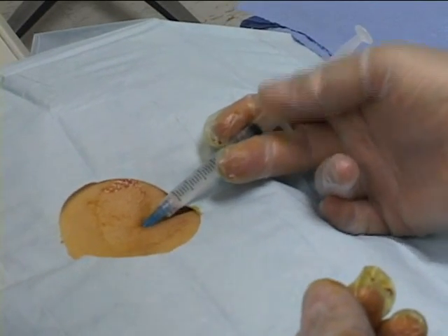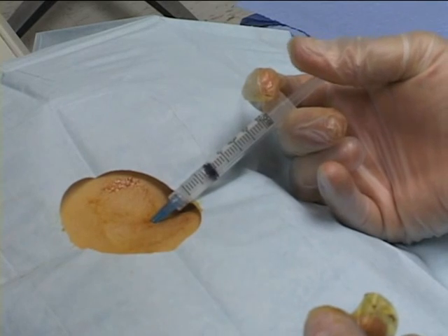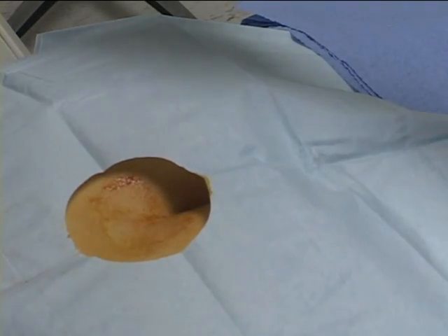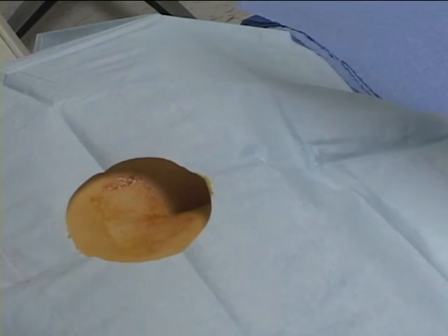It requires the use of a Tuohy needle. A Tuohy needle has a blunt ending, and the opening of the needle is to the top, so as we push it in, it doesn't tear up the different structures and nerves.